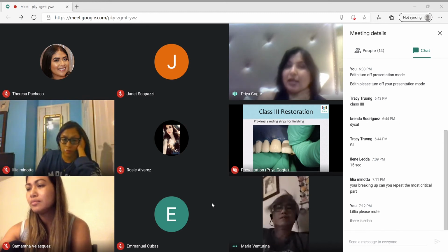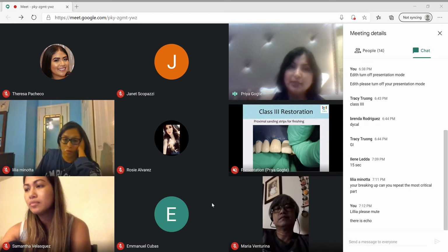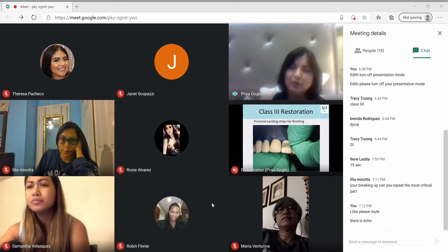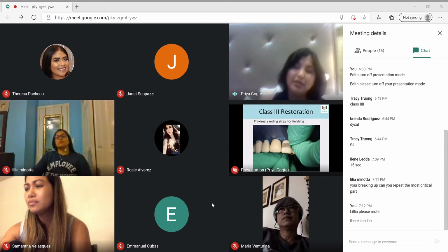And I'll do it tomorrow, and then you guys can see how I do it. And I use micro brush all the time with the bond. That I have to use, because otherwise, just with an instrument, I feel like it's sticking too much. And even if I put the bond on the instrument, somehow I feel like with the micro brush, I'm able to shape it or contour it a little better.